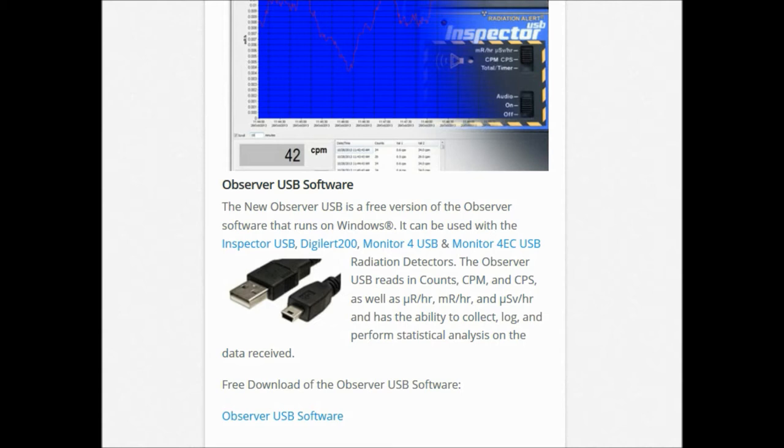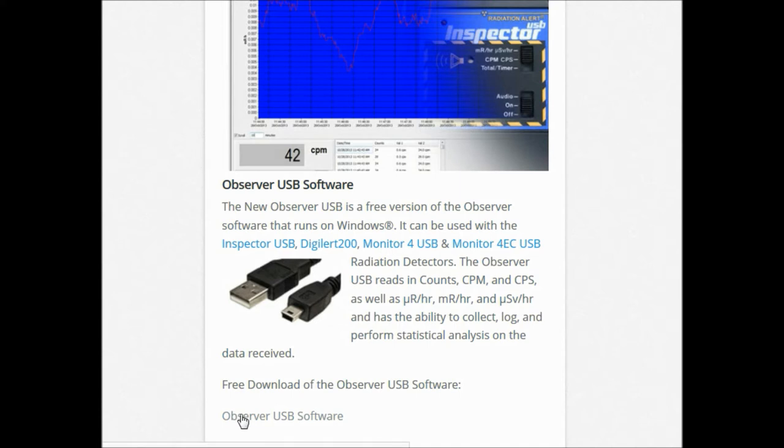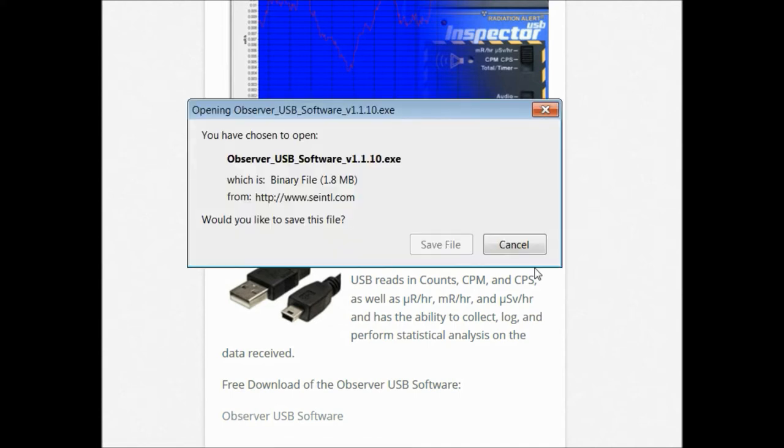To get started, first you'll have to download the software from their website. You can get that for free at seintl.com/software. It'll take you to their software page and you just click on the link titled USB Software and begin downloading it.